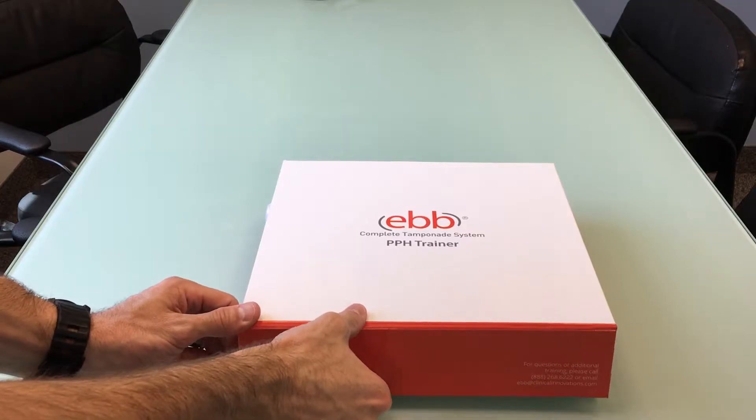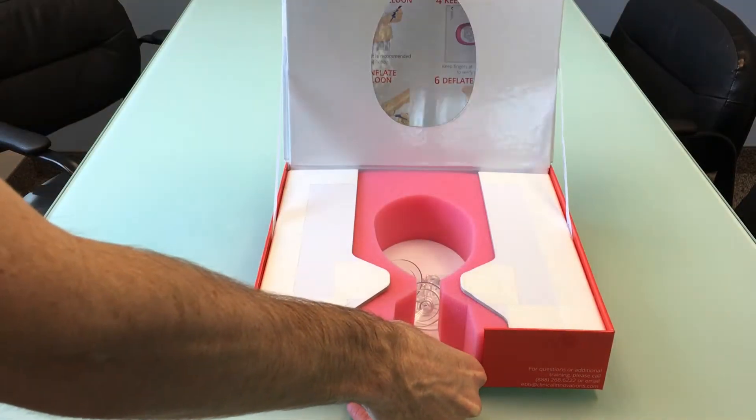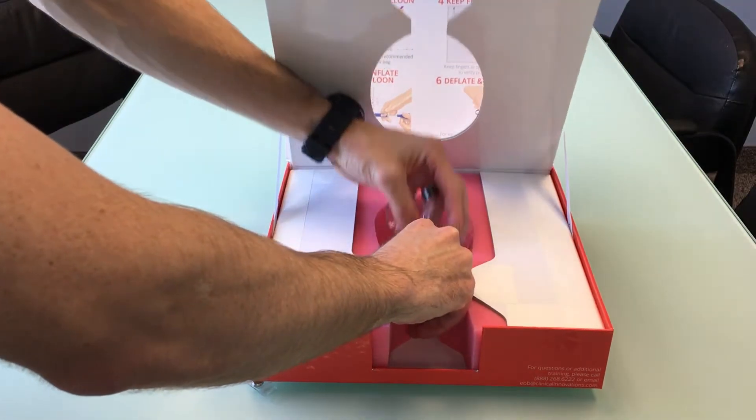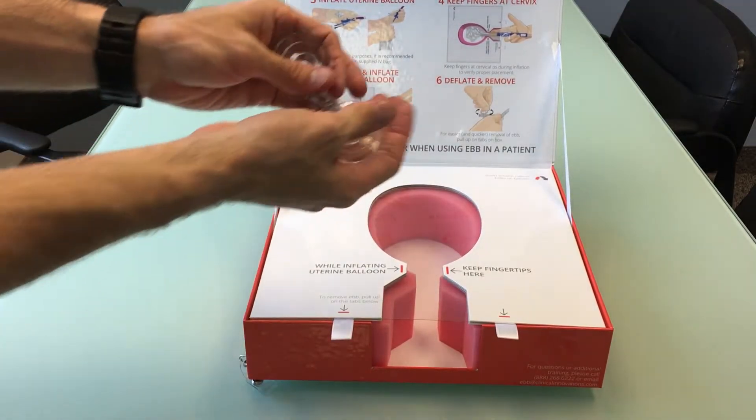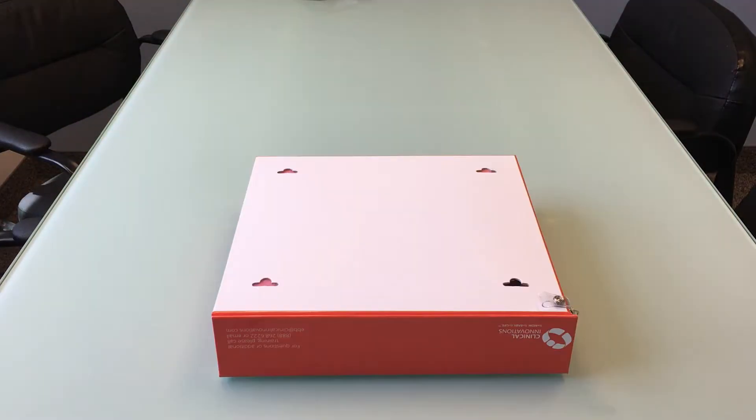When you get your box, if you open it you'll find suction cups located inside the uterus underneath the lid. Open the flap and remove the suction cups — there should be four of them. Turn the box over and insert the suction cups.